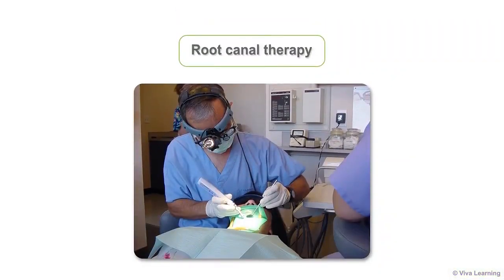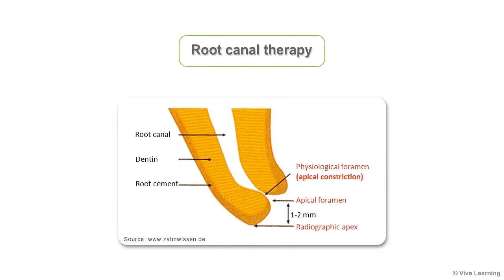One of the keys to success in root canal therapy, a procedure in which the nerve and pulp of a tooth are removed, is to be able to determine the correct endpoint of the root canal. The recommended point is the physiological apical foramen, also called the apical constriction. Normally, however, this is not a fixed or defined point, but rather a distance from the radiographic apex. Depending on the methodology used, determining exactly where this desired stopping point is located can be difficult.